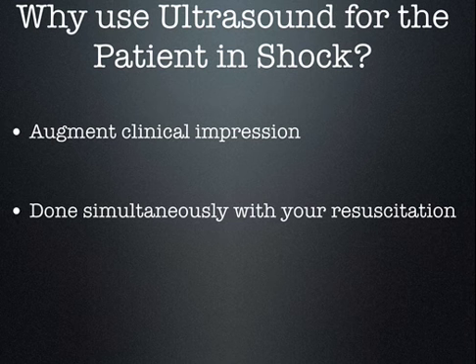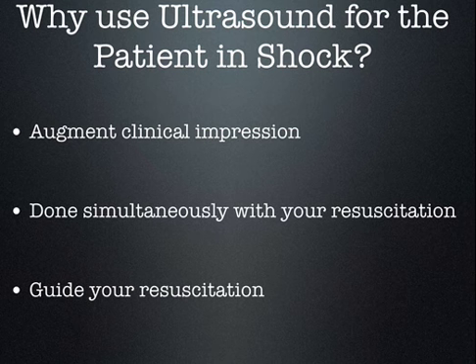Well, when I get a right upper quadrant abdominal pain, I drag my ultrasound machine in there. I'm doing my history while I'm doing the ultrasound at the same time, and then I do my physical exam as well, okay? So this can all be done at the same time, and it can be used to guide your resuscitation, as you will see, and the patient never leaves the safety of your care in your resuscitation.